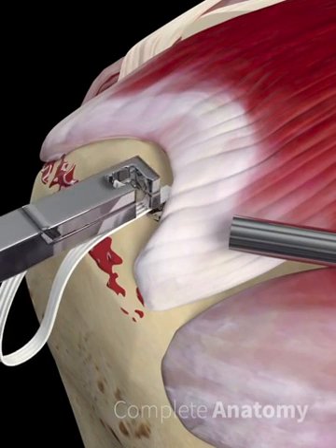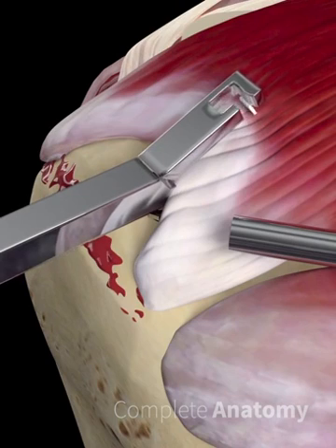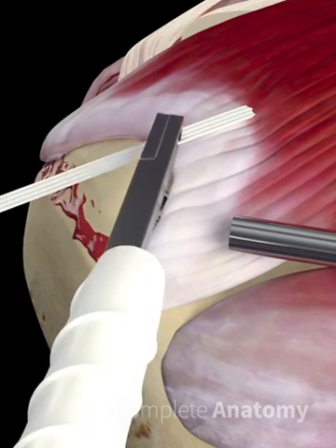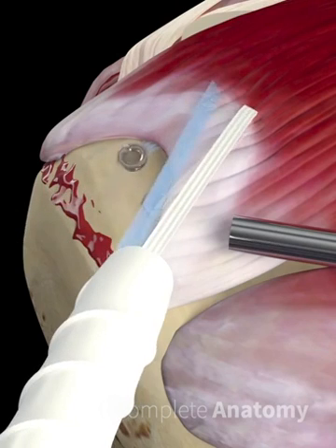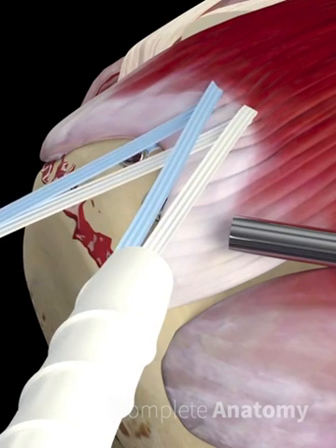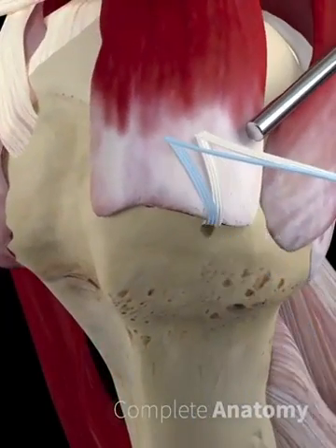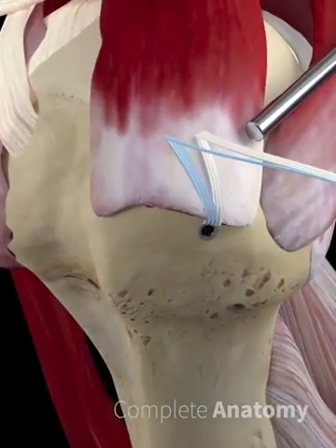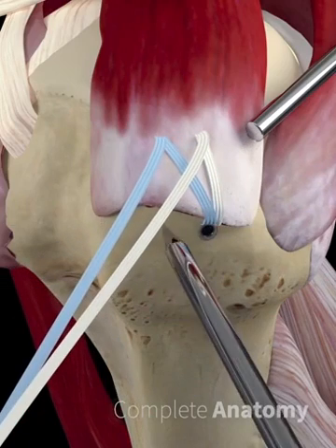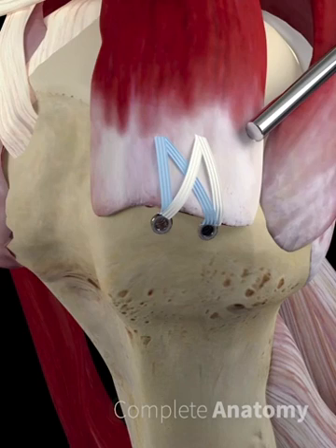Sutures are brought through the tendon and are fixed to the anchor sites. The shoulder incisions are then sutured.